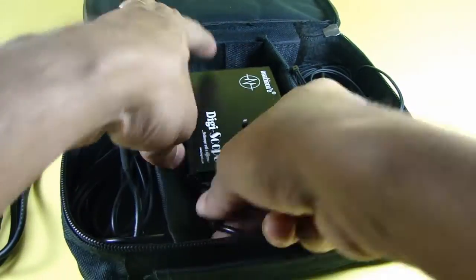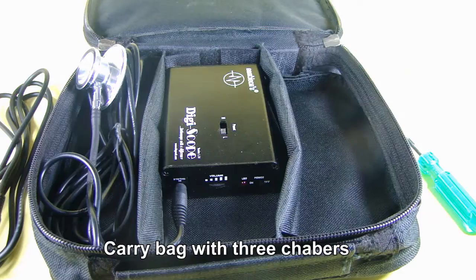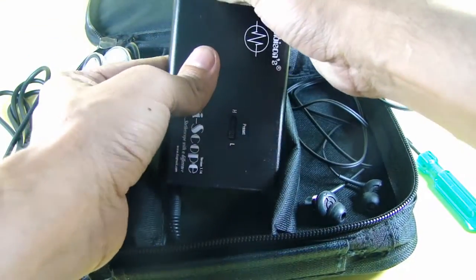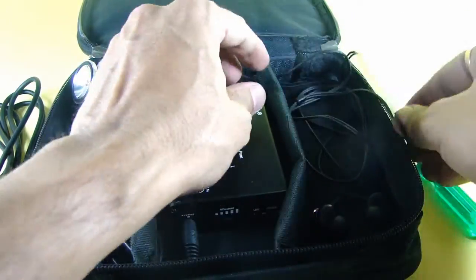The chambers have been created keeping in mind the needs of a doctor. The doctor can make connections inside the carry bag so that he doesn't have to bring out the unit every now and then, and the wires also stay in place.